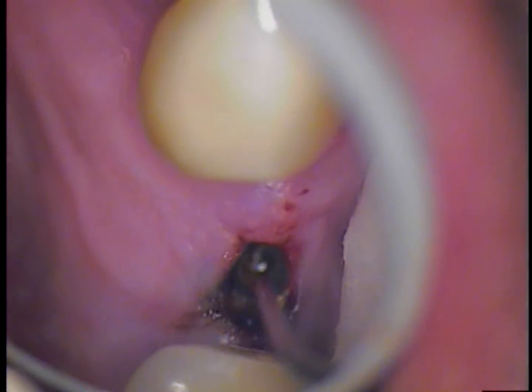Hello, this is Dr. Jerry Cuomo and welcome back. We are in the mouth now with an uncovered Biomed 3i broken screw retrieval case.